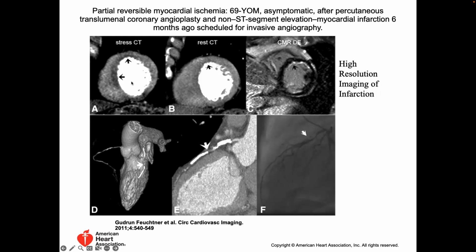And we saw, again, if we recall, how big the artifacts are from, say, the shadow that's cast by this contrast in CT, right? As the X-rays are coming through, you get beam hardening, all this stuff happening, changing the signal value around it. But we'll say this is a positive stress CT. What you don't appreciate in this CT is that this chunk of tissue right here, which is all along here, is dead. There's an infarct, and it's a really narrow and thin infarct right there, right?